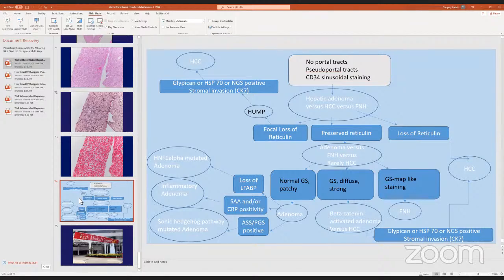Thank you. And one very important point that you have mentioned is when the patient is male. So if it is a male patient and the radiology sometimes suggests that this is a single lesion, adenoma on radiology is likely, then what is your approach in a male patient with such a lesion on biopsy? If you're sure it's an adenoma, then sure, you call it one. But if you're not, then just call it atypical. Most male adenomas go to resection regardless of what you call it.